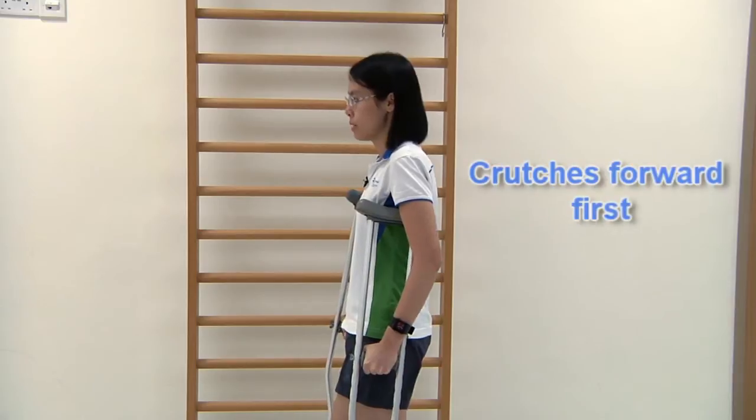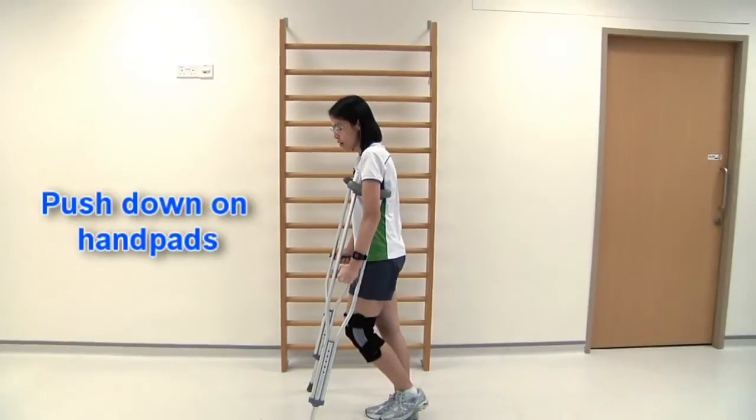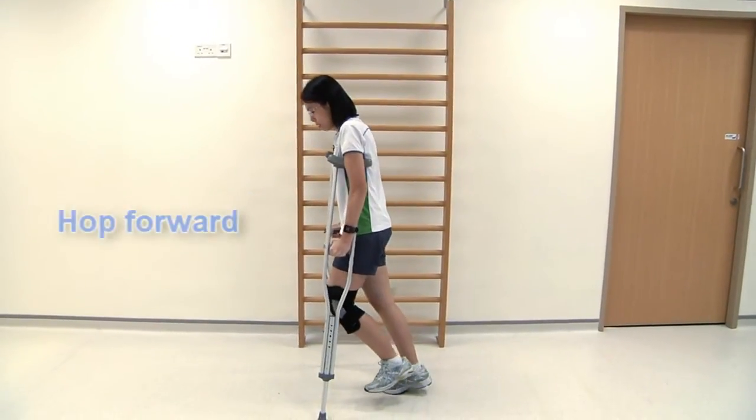To start walking, place your crutch one arm length forward. Push down on the hand pad and hop forward.